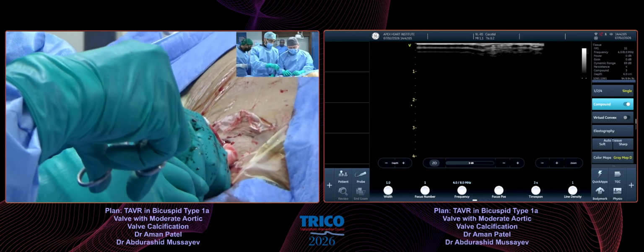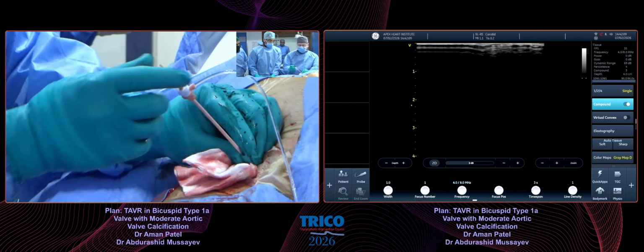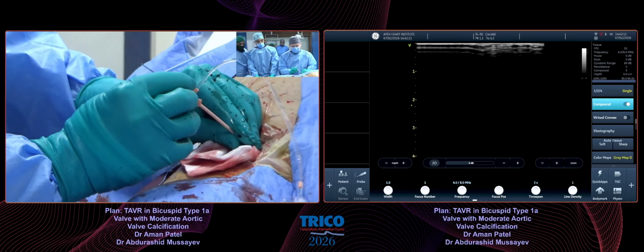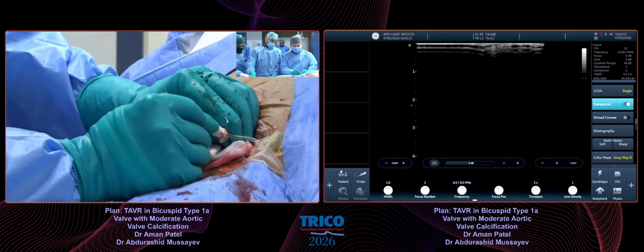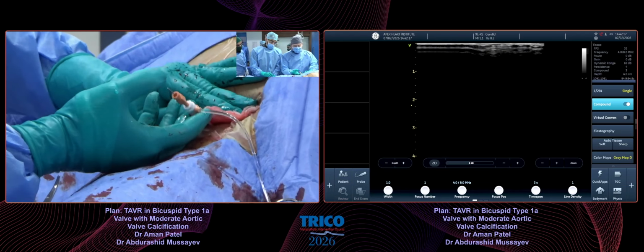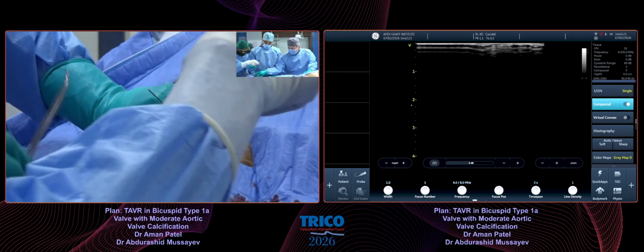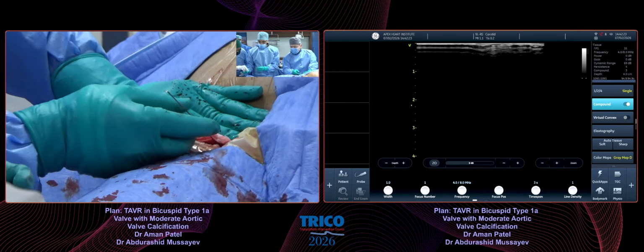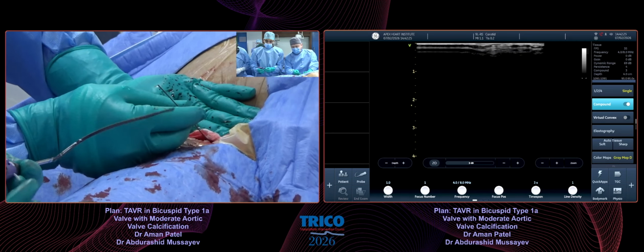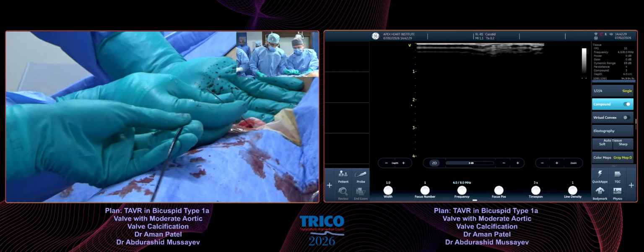So always when you puncture the micropuncture and pass the wire, once the wire goes in smoothly, stop there, do a fluoroscopy, pass this wire under fluoroscopy all the time. As the doctor was telling, it can go in various branches. So always advance the micropuncture wire under fluoroscopy. Yes, it depends on protocol. We had our own share of perforation with a micropuncture wire going into the.